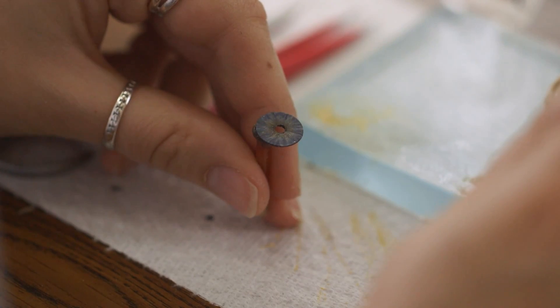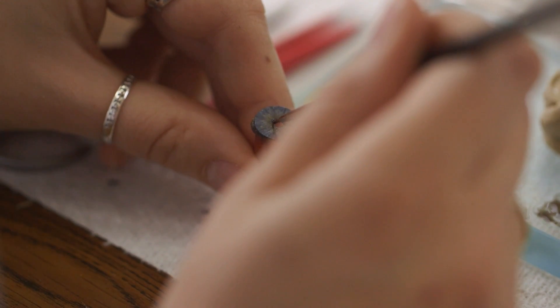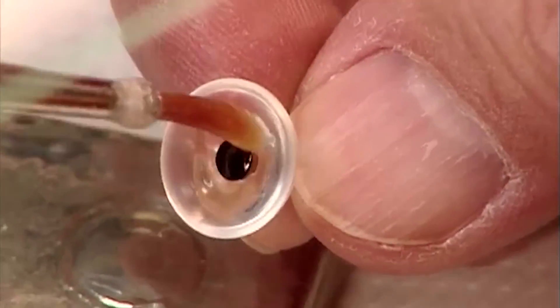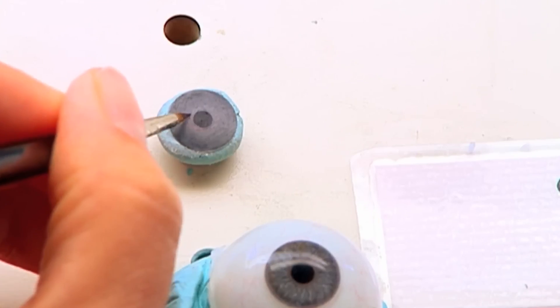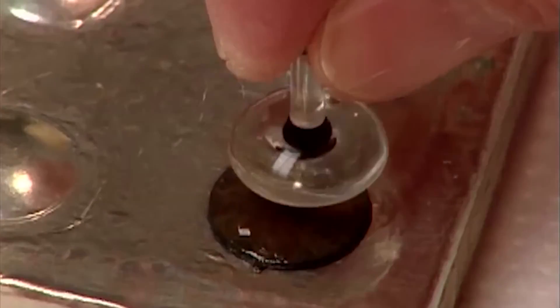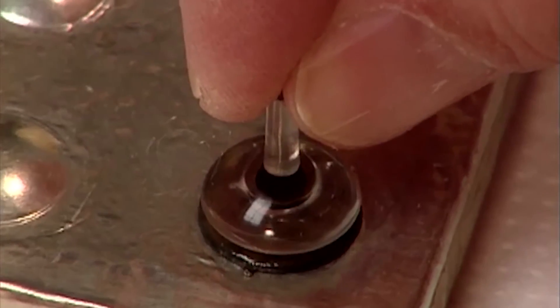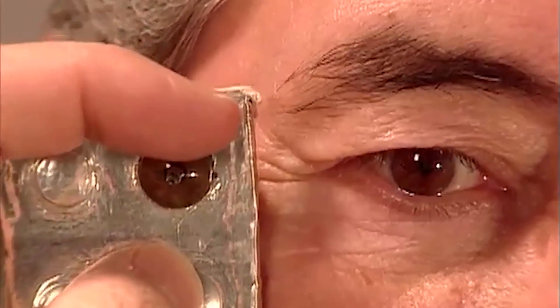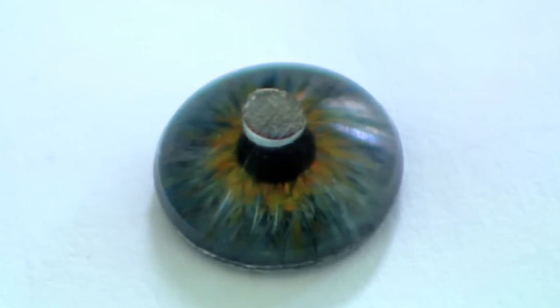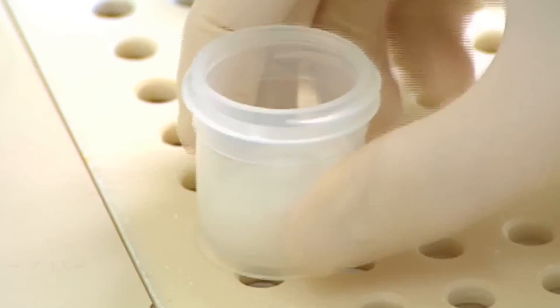The iris, or colored part of the eye, is painted onto a flat plastic disc measured to the size of the patient's remaining iris. Each iris is hand-painted using oil-based paints, and the technicians work from either a digital photo or a previously painted eye to ensure it will match the other eye. After 18 hours, the iris paint is finally dry and gets pressed into a button-shaped disc, putting a curve on top of the iris so it will be flush on top of the round eye. The iris is then placed upside down into the prepared mold.